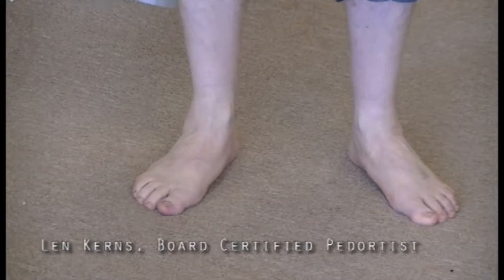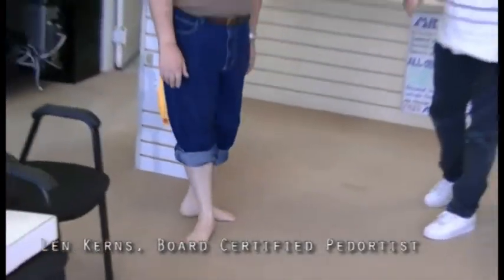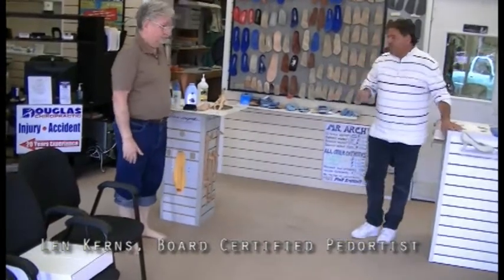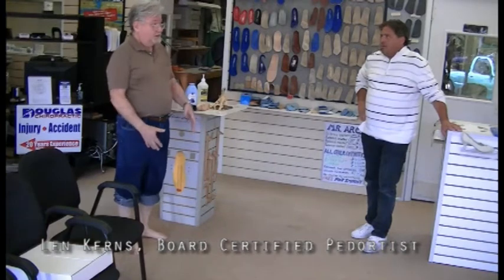So now we're going to do the gait analysis. Stand where you are. Show the patient what he looks like. You could demonstrate to the doctors also. And this is where the patient's going to learn exactly what neutral is, and what they're doing that's causing a lot of their pain, what their foot is actually doing. The patient will actually get to see this once you show it to them on film.